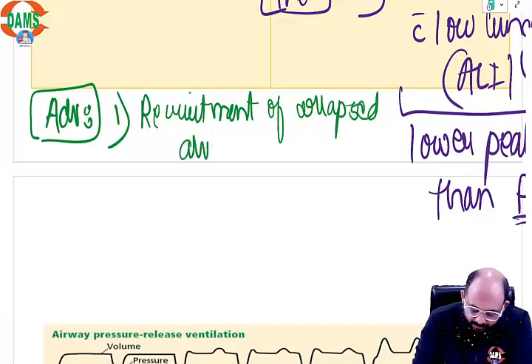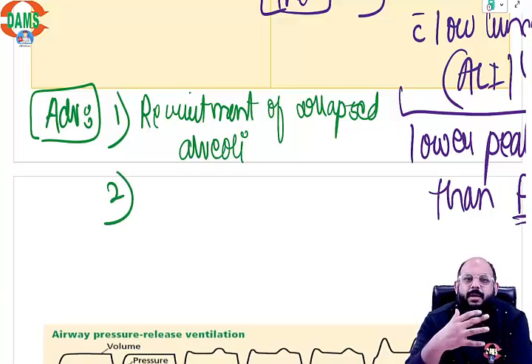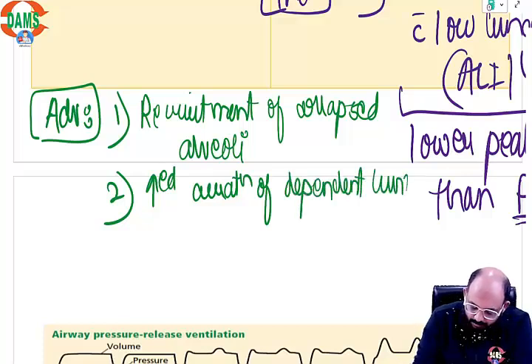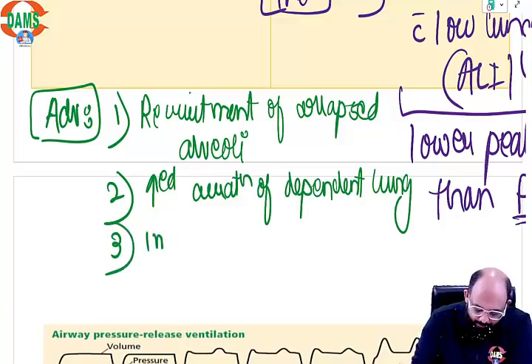See, anywhere where you do not allow the patient to exhale properly, the alveoli will be open and there will be recruitment. Increased aeration of dependent lung.